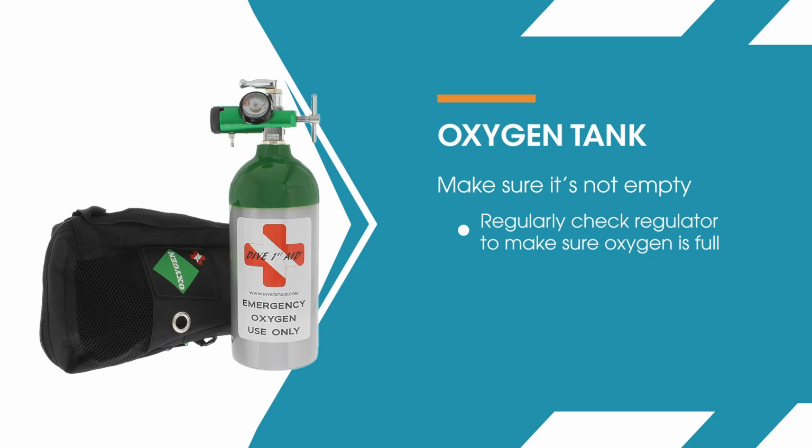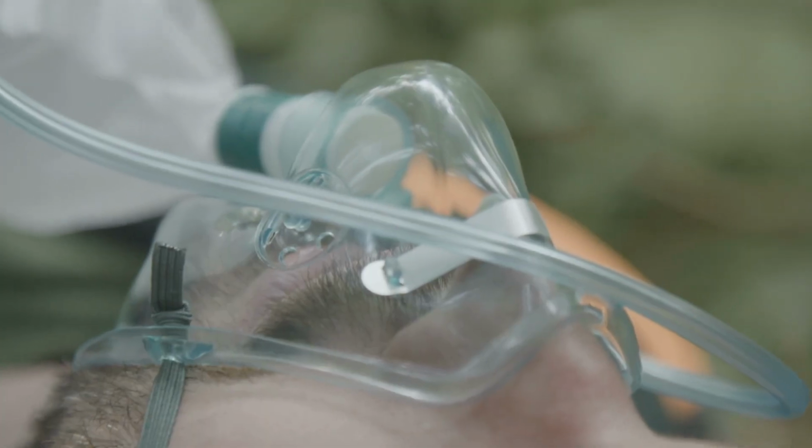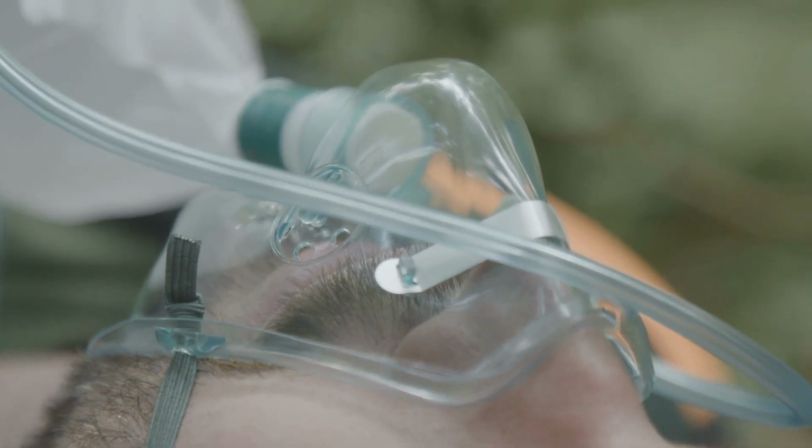You know, in our situation, oxygen is not going to be a life-saving tool. There's no situation that we have that oxygen is going to save the person's life. And if that's our goal, it's not going to be your first grab. What I like to do for oxygen, I always like to attach the ambu bag to the oxygen tank because I feel like that's the only time you're really ever going to use it. But if you need the ambu bag, you can use that without oxygen too. It doesn't matter, you don't need the oxygen. So that is something that is emergency, but just know that oxygen has kind of been put on the back burner for us. Oxygen is very important, but for us, it's not going to be our first line of defense.